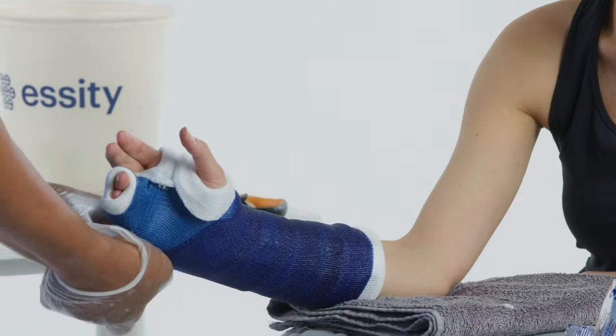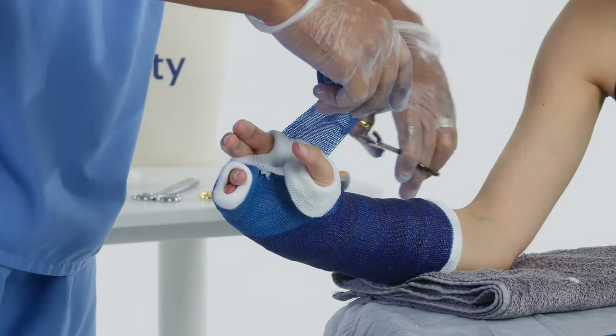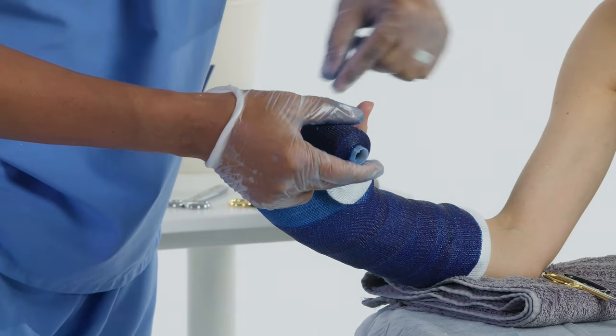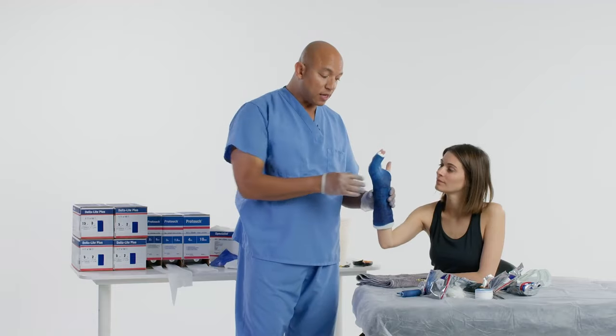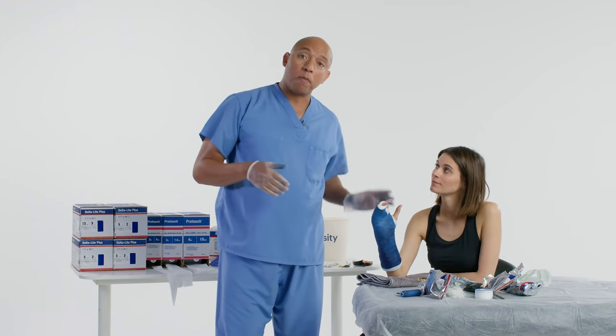Let's try to finish this up and make it look as neat as we can. I'm going to do what we did on the short arm cast — a little J-cut — round it, shorten these little fiberglass edges out, wrap that around, and do the same thing in that web space, flipping it back up. What I just completed is a short arm ulnar gutter boxer cast. The ulnar side is incredibly strong because I added that splint. Hopefully this technique adds to your repertoire of more difficult, advanced casts. For additional support or training regarding Delta Cast products, contact your local rep or visit www.essity.com.